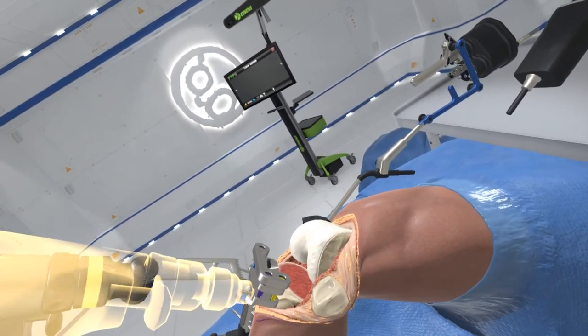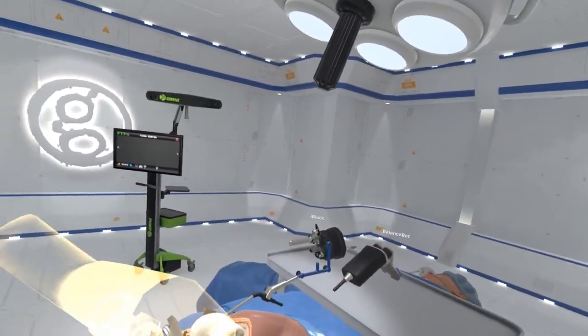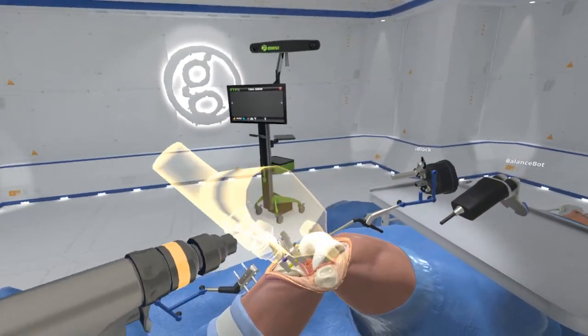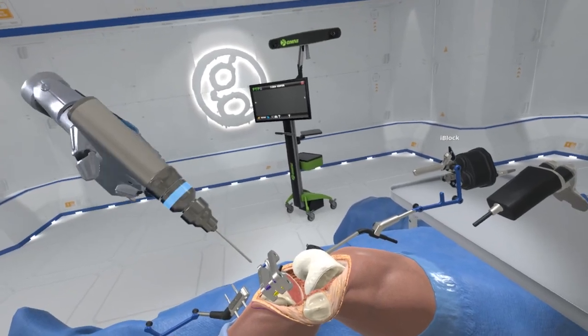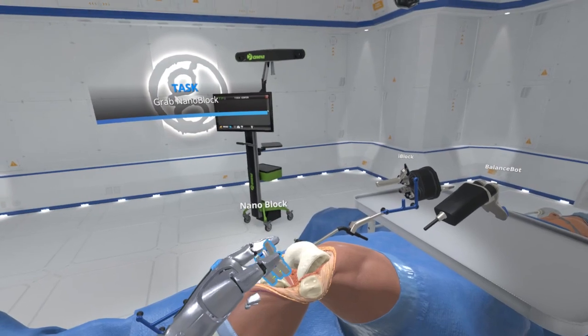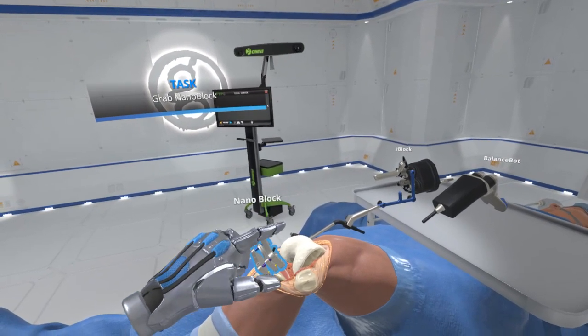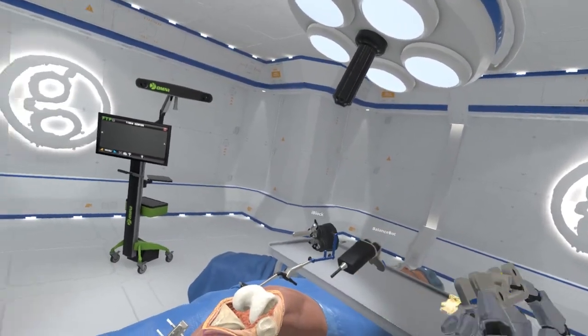The nanoblock can now be removed. Grab the pin driver to remove the anchor pins from the nanoblock. Remove the first anchor pin. Remove the second anchor. Remove the final. Grab the nanoblock. Return it to the Mayo stand.